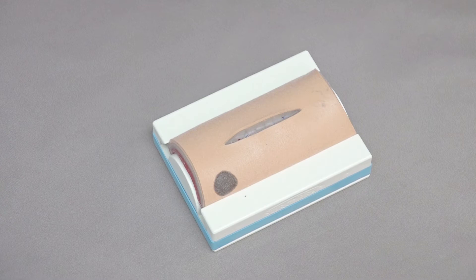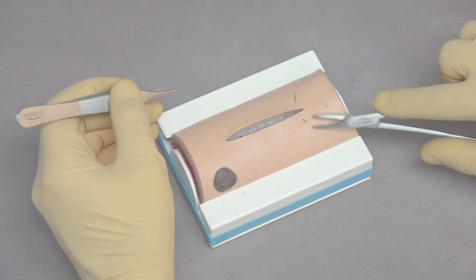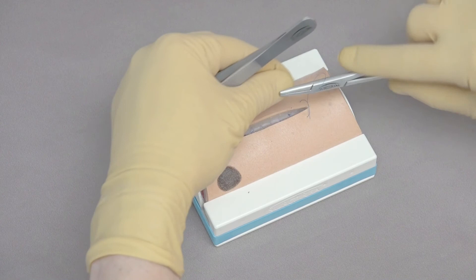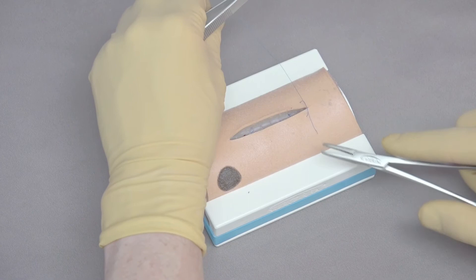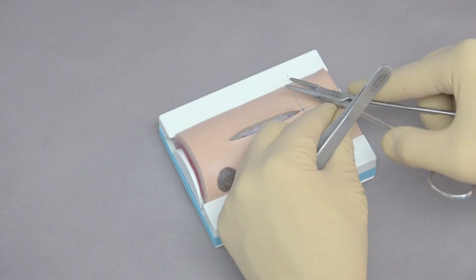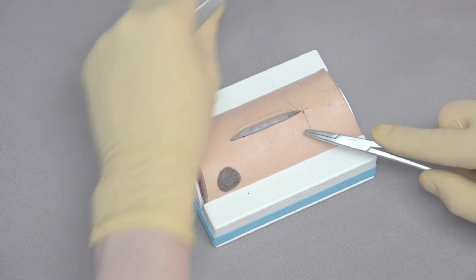To close the skin, you can use either a continuous pattern or simple interrupted. It starts much like a simple interrupted pattern — go through the skin on both sides, bring the suture through, and close with a simple interrupted or continuous pattern. Note that monofilament nylon has a tendency to loosen, so leaving a little more tail is better. Come back, snug that down, and you can see how it tightens nicely. Continue using the rest of the suture pattern with four throws, then close as a continuous pattern.